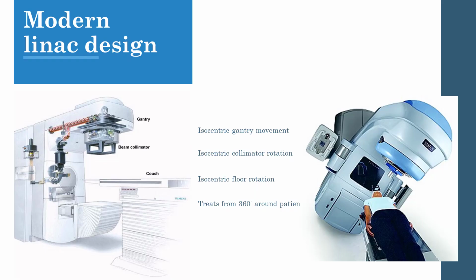Now we can look at more modern design. The image on the left is more like the old style clinics, and you can see from the diagram that there's a rotational gantry with a waveguide passing along to a collimator. The concertina panel coming out is an imaging panel, allowing for the use of X-ray images to be taken while the patient's on the bed.